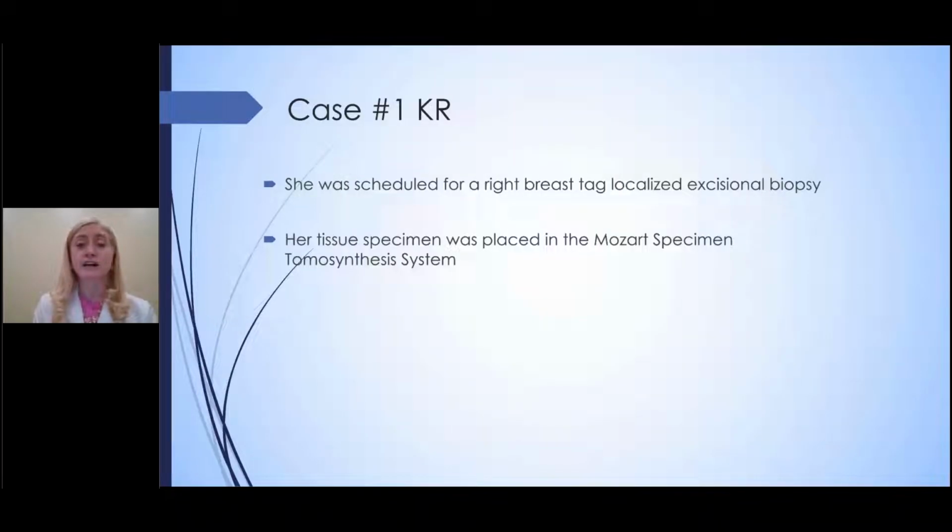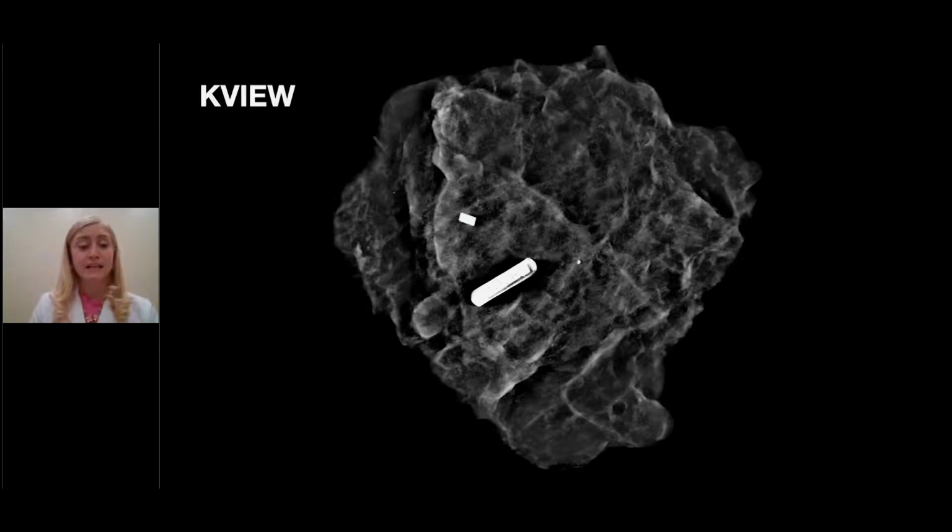So this patient was, of course, operated on at Lincoln Surgical Hospital, which is an outpatient surgery center, and she was scheduled for a tag localized excisional biopsy. And during the surgery, her tissue specimen was placed in that Mozart specimen tomosynthesis system. This is her image, and we can see the tag is the larger in the specimen, and her clip is that smaller piece there. And we'll go ahead and scroll through her images.